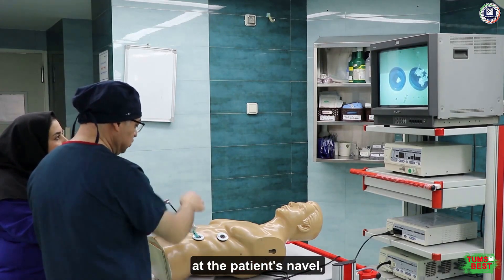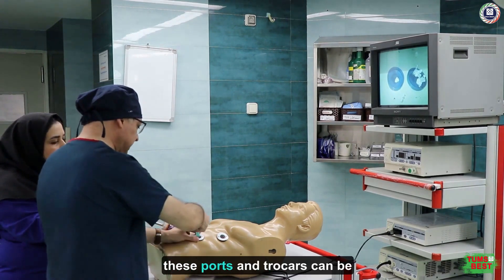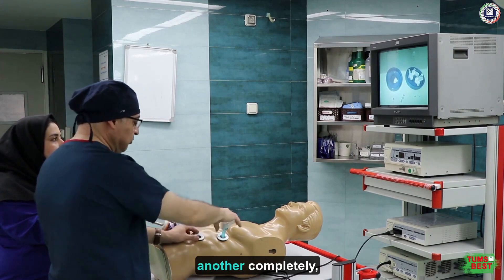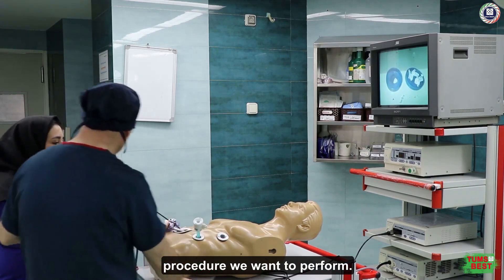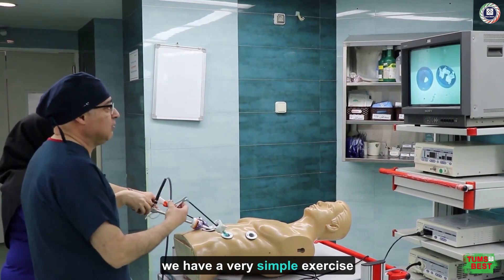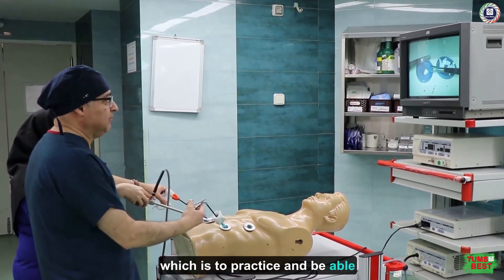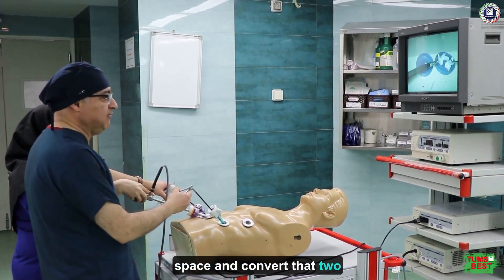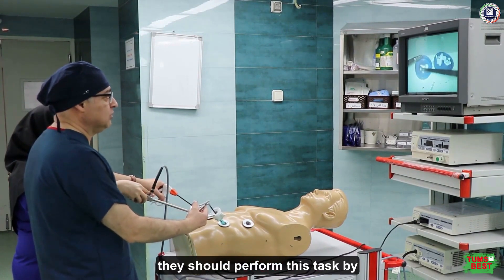Typically, since the camera is positioned at the patient's navel, we have placed it here. These ports and trocars can be rearranged — for example, one can move from here to another, completely depending on where we want to conduct the training and what procedure we want to perform. Ms. Islami, a room expert, is helping me as a camera holder. We have a very simple exercise for the experts: to practice and develop good spatial recognition in two-dimensional space and convert that two-dimensional thinking into three-dimensional.